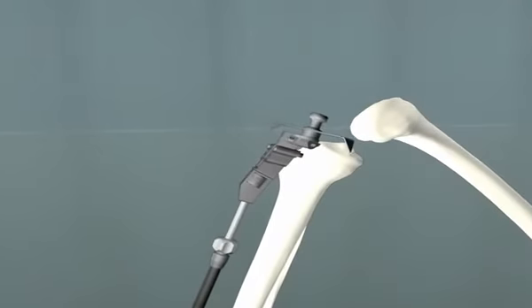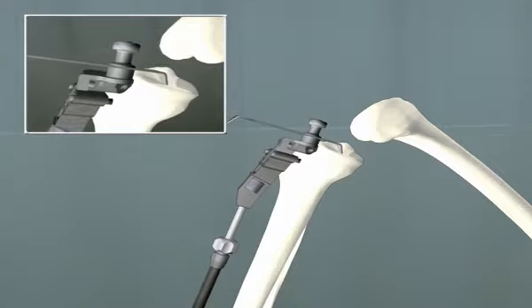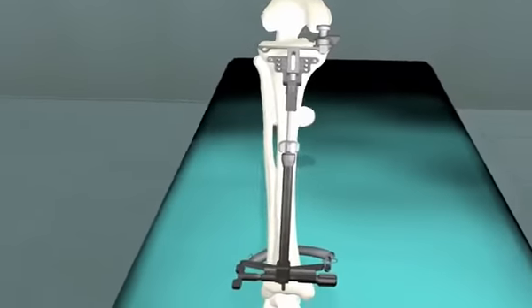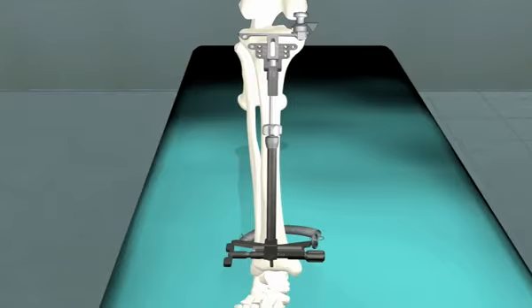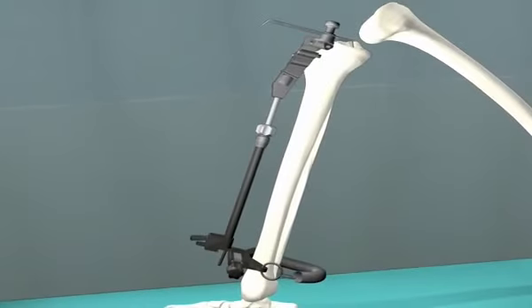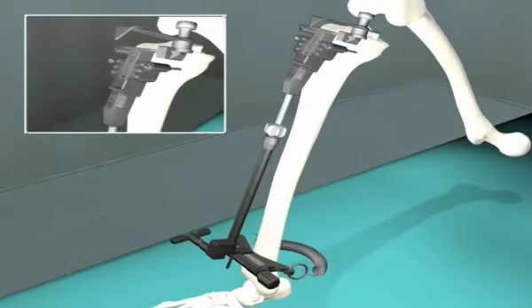The resection caliper guide can be placed on the upper portion of the guide to find the lowest point of resection, and this can be adjusted depending on the pathology encountered. The guide can be positioned medial laterally in the distal plane using the micrometer type guide. The guide itself can be moved anteriorly and posteriorly to get the desired posterior inclination angle, which lies between 5 and 10 degrees. The guide is then pinned into place.